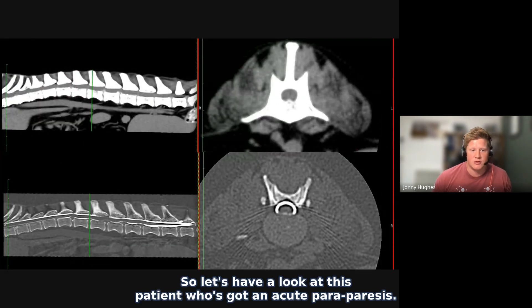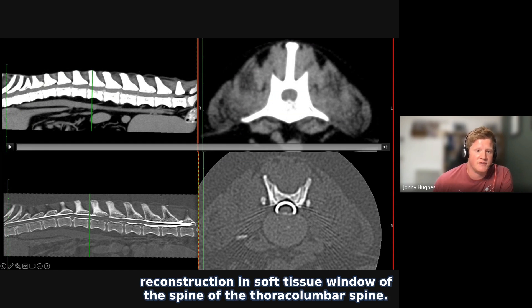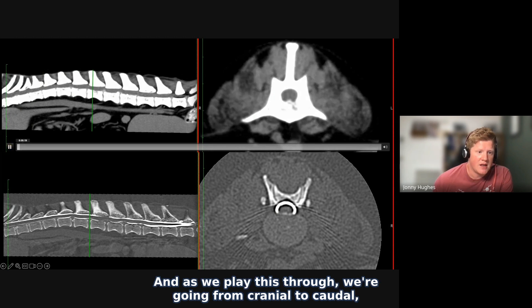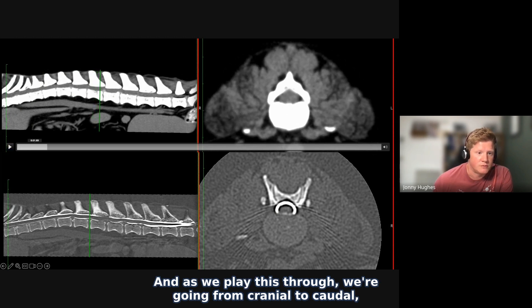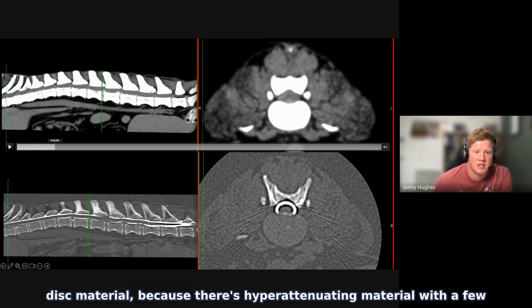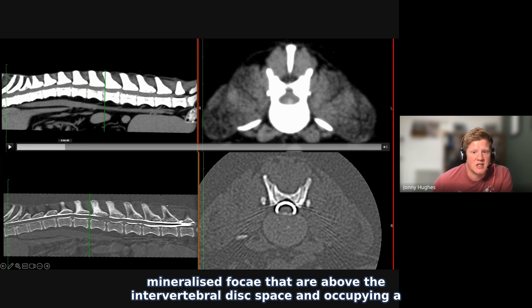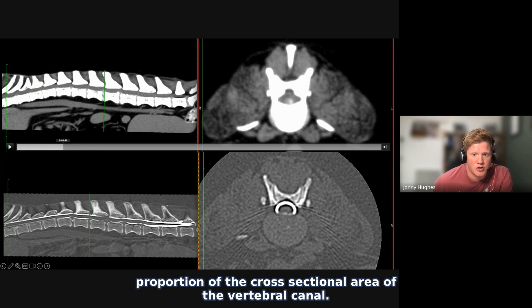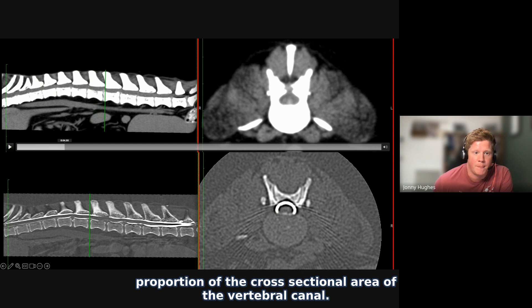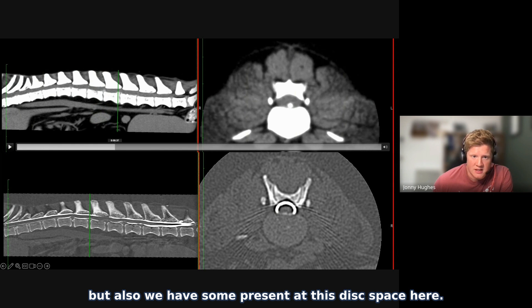Let's have a look at this patient with acute paraparesis. We have the initial sagittal reconstruction and transverse reconstruction in soft tissue window of the thoracolumbar spine. As we play through going from cranial to caudal, we reach locations where there's evidence of herniation of intervertebral disc material — hyper-attenuating material with a few mineralized foci above the intervertebral disc space, occupying a proportion of the cross-sectional area of the vertebral canal. It's present at this disc space and also at this disc space.